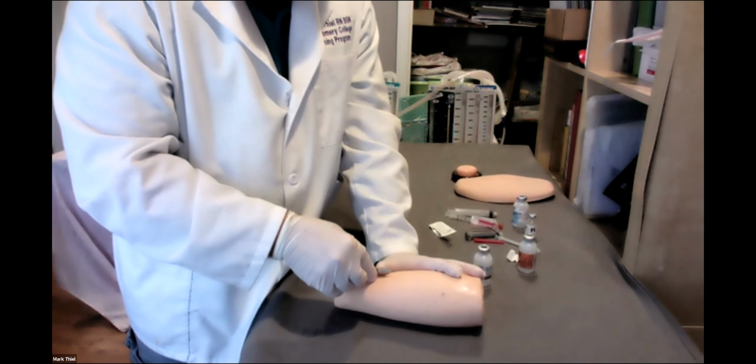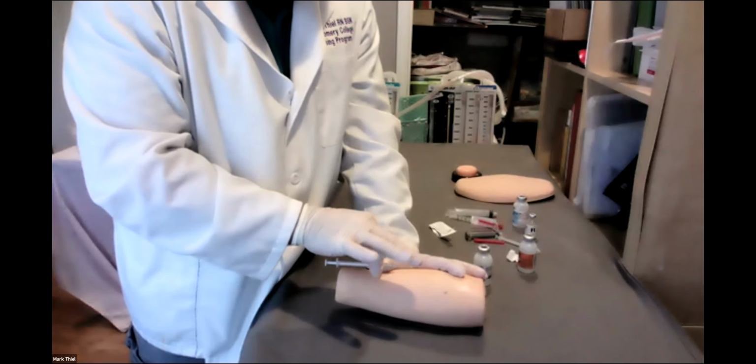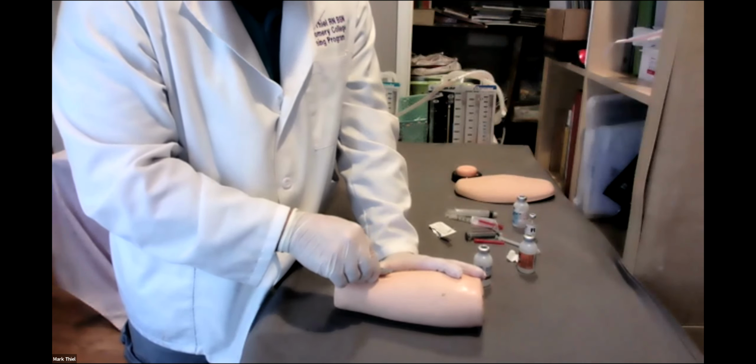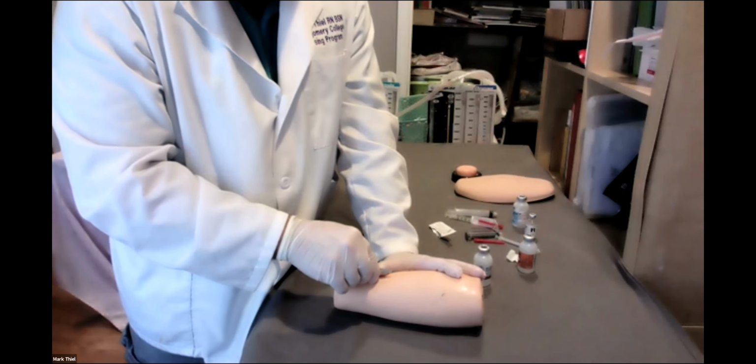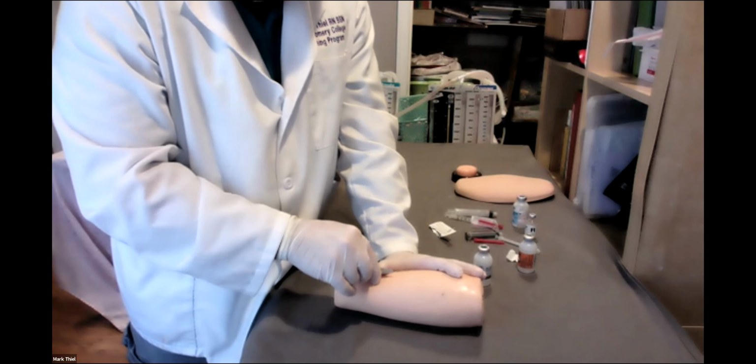And we will be coming in at an angle of about 10 to 15 degrees. The bevel of the needle, that's the angled tip to make it sharp, is up, not down.